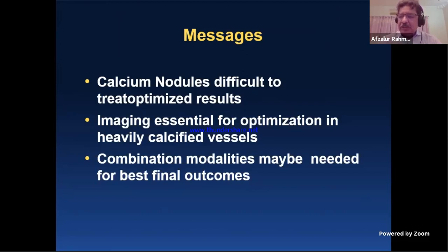And Ashok, you have dilated the LAD. That is very tortuous with an aneurysm. So which lesion is an absolute contraindication for rotablation? And how far will you try for that? This is a fantastic case, but you tackled it very nicely. Both presentations are very elegant. Every presentation is very elegant. So, thank you.